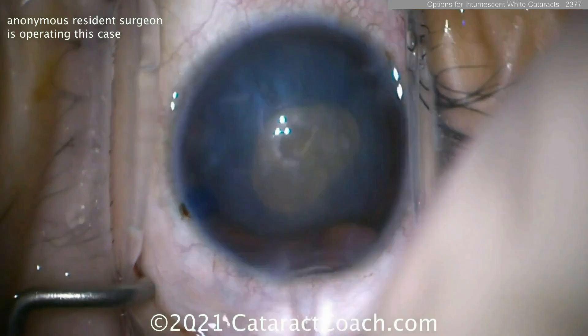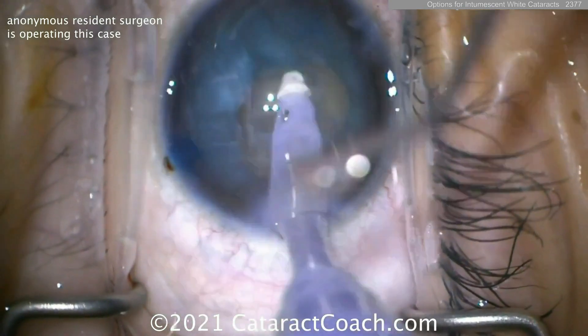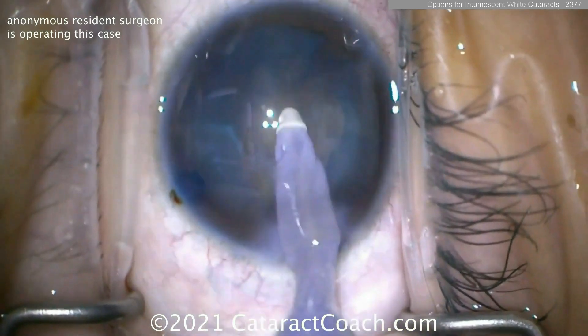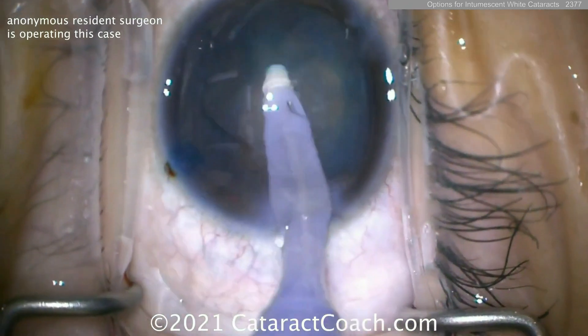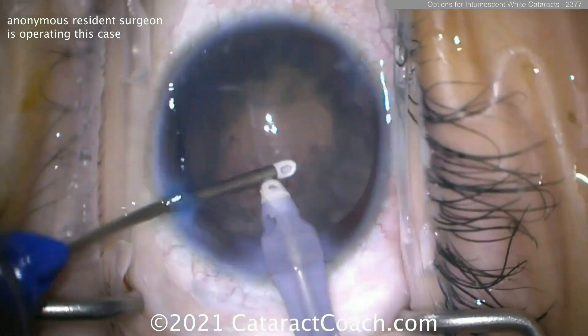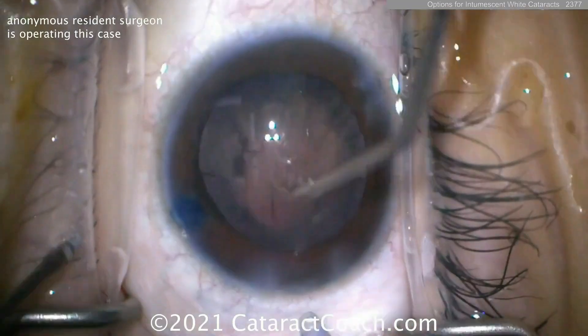Now what do you do with this ugly rhexis? Well, let's decompress the bag by aspirating out all that lens material. Again, no nucleus here — just soft lens cortex in a young patient. And now at this point, once you remove all that, you can put the lens in and clean up a little bit.